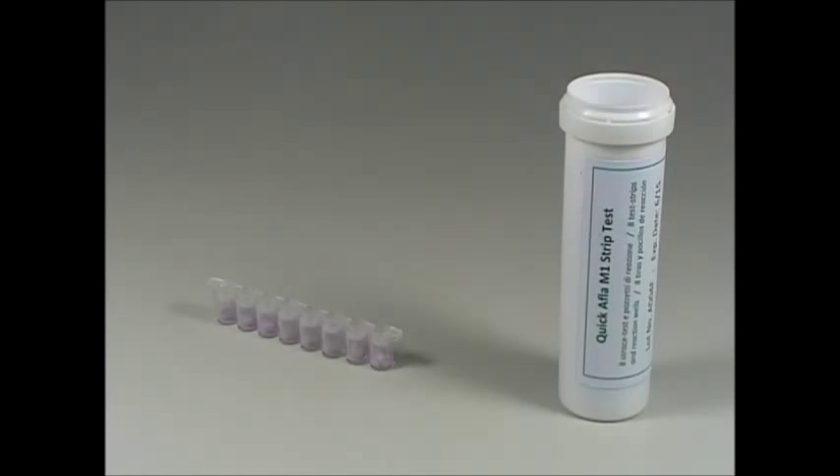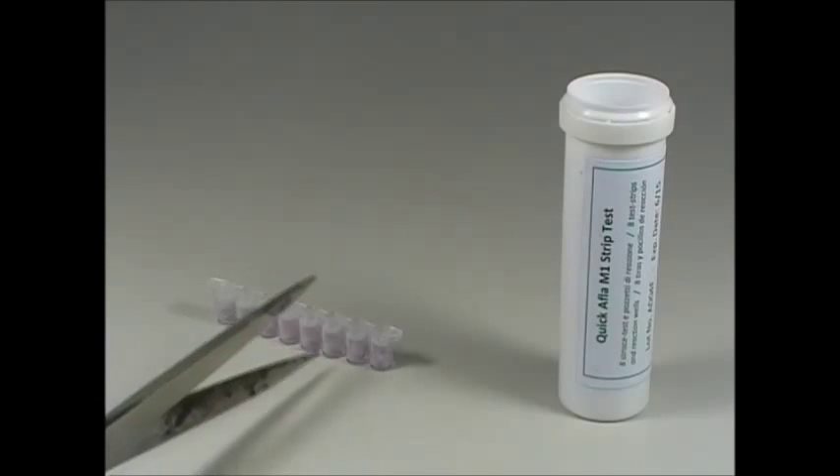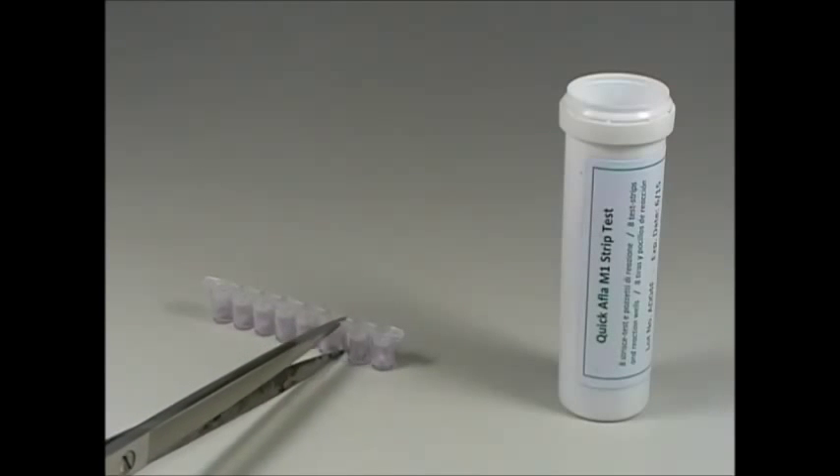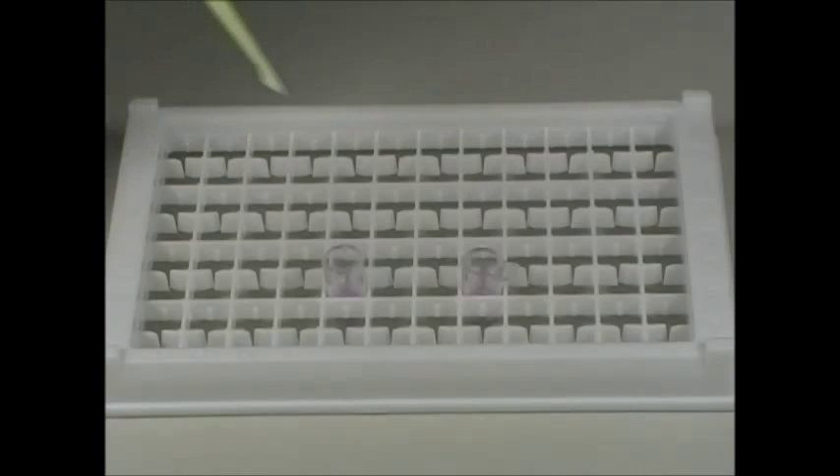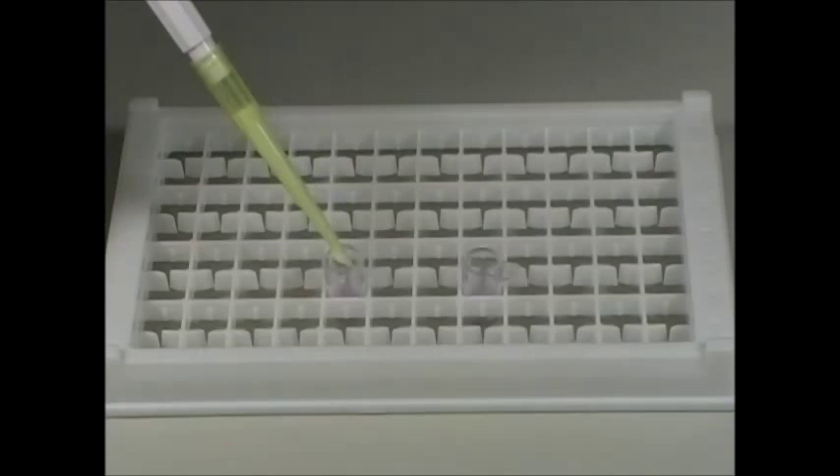Then, cut and remove the exact number of reaction microwells according to the number of samples needed. Dispense 200 microliters of milk in a microwell.